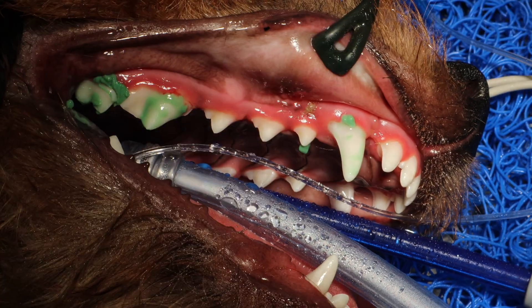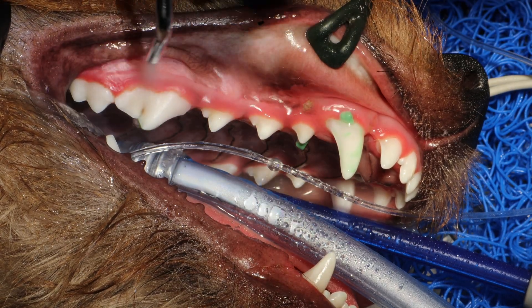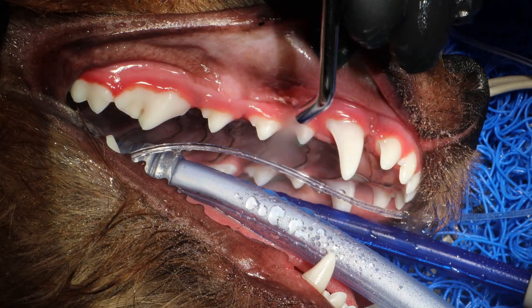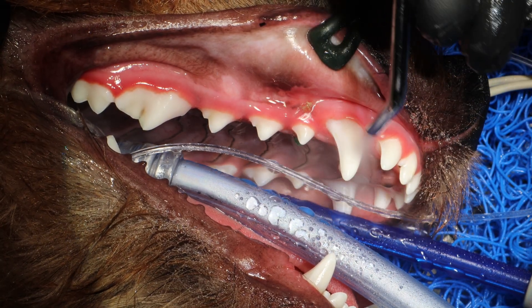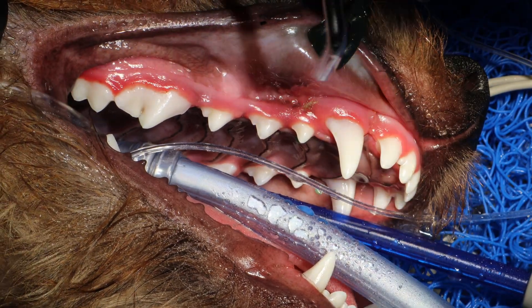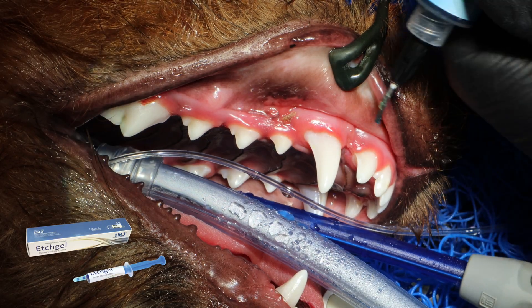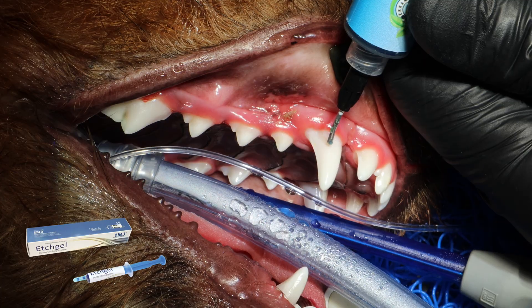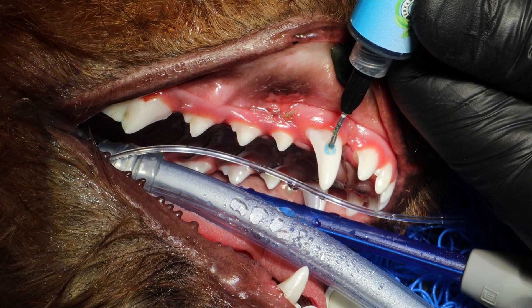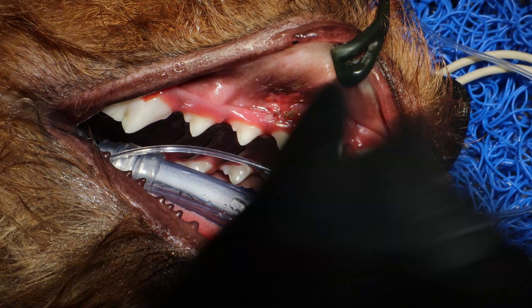It's important that the base will be stronger than the tooth you are trying to move — the anchor. Because if you put an elastic band between two teeth they will move together, and the weakest anchor will be the tooth that moves. You may have a situation where the anchor is not strong enough and it's the molar that you are moving instead of the canine tooth. You don't want that.